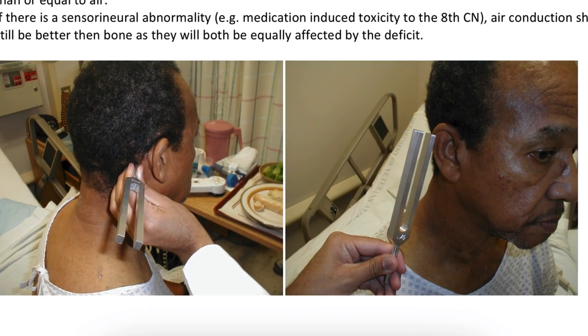In the Rinne test, we place the tuning fork on the mastoid bone for checking bone conduction. Then after that we keep the tuning fork near the ear for checking air conduction. Bone conduction and air conduction are important because, in interpretation, normally air conduction is greater than bone conduction.